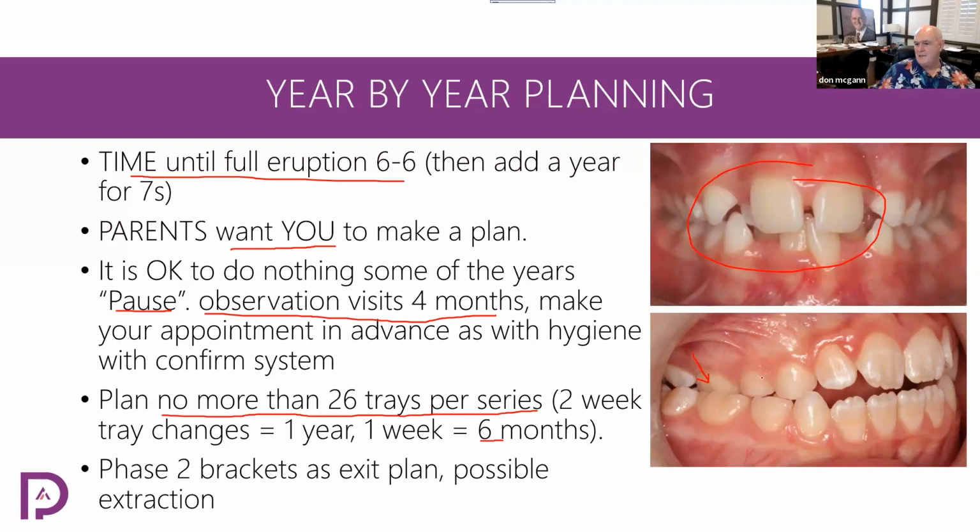This one, I might say, I'm going to be taking out the canines. I'm going to take out the canines. I want you to line up all these teeth. I want you to give me 8mm bubbles on the upper and 7mm bubbles on the lower. Straighten the teeth for me, please. Okay? Oh, and I want to expand. I don't want everything going advanced, and I want lingual root torque on 3-1.